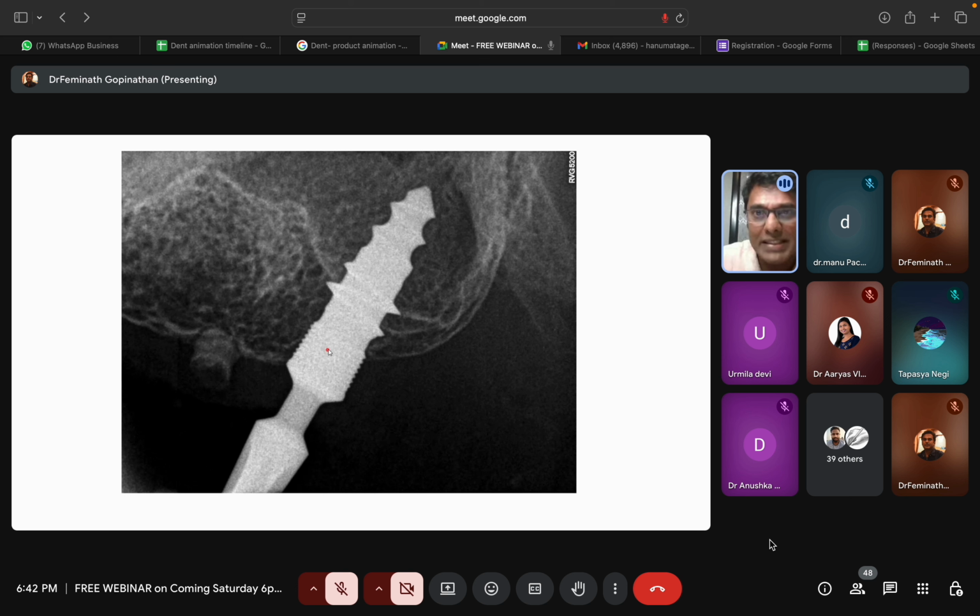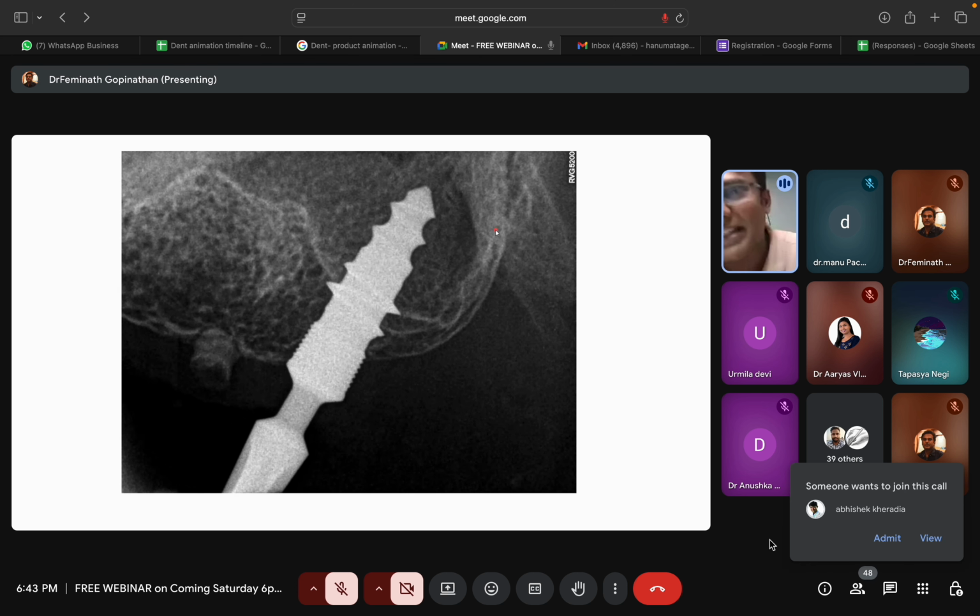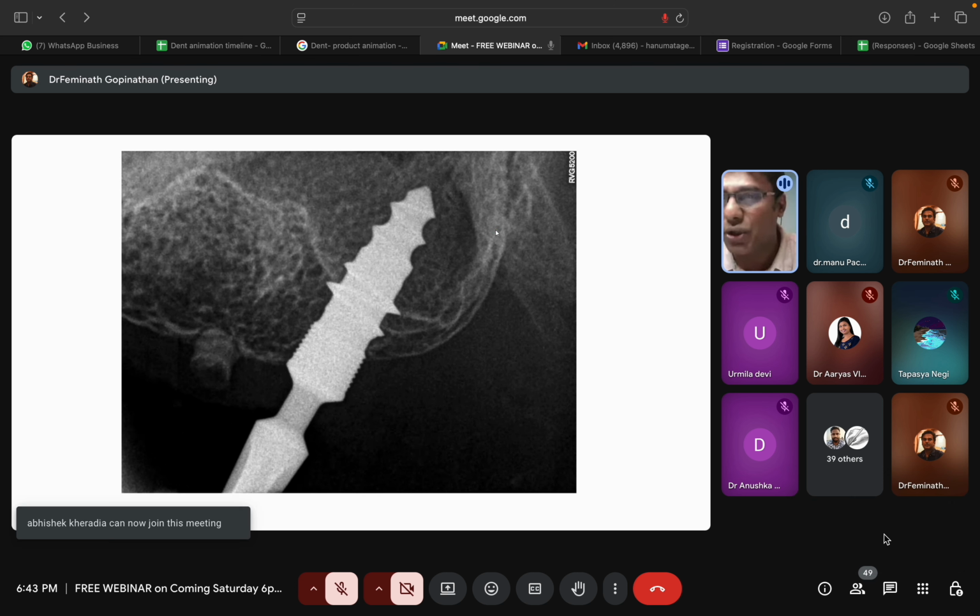The implant was placed, was not placed. During the implant placement, I got some resistance. So I just wanted to confirm whether my implant has reached the pterygoid plate. Occasionally, especially in the case of the pterygoid area, when I place, I try to take an IOPA to reconfirm whether I am going in the right direction. If you are an expert, you don't need to, but I always prefer to err on the side of caution. Now see, I'll just draw for you.